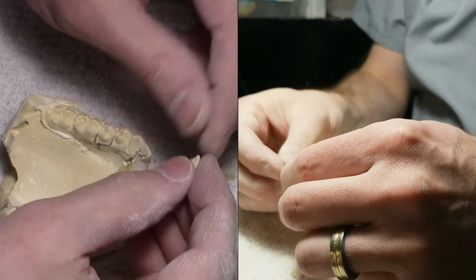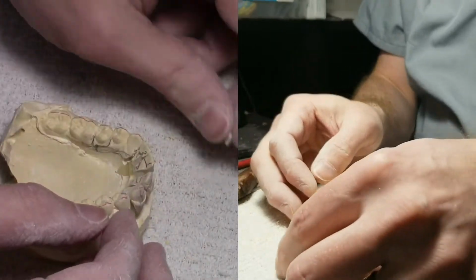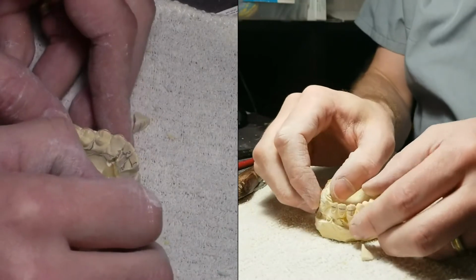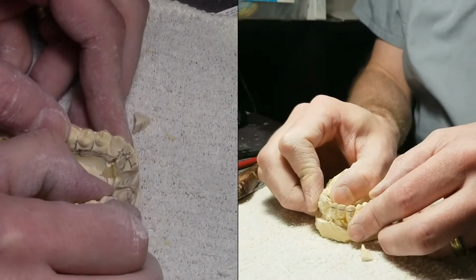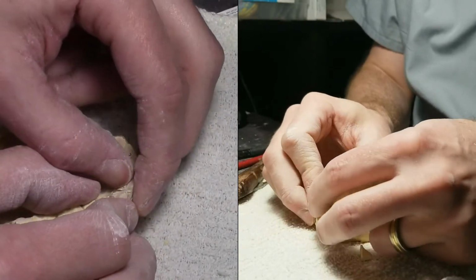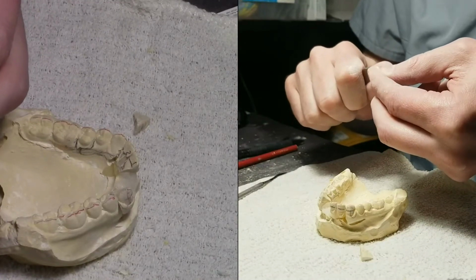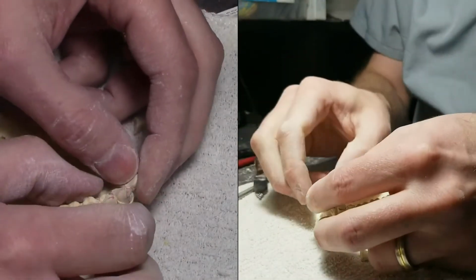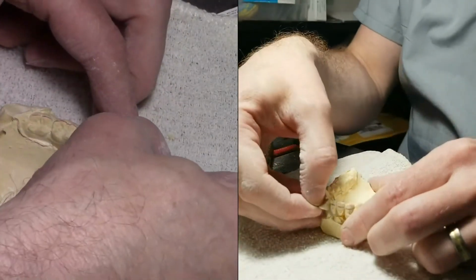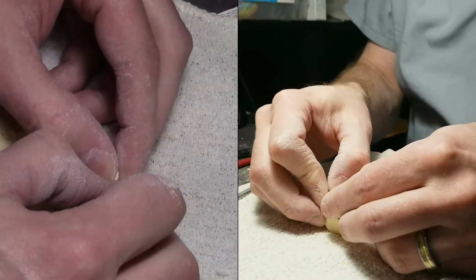Alright, so let's move on to the next one. Look at that. I'm running out of room, so I'm going to kick that canine back out. Slide that 2 back into place. There's a little bit of stone left over. There we go. And let's see if we can get this one to squeeze in here.